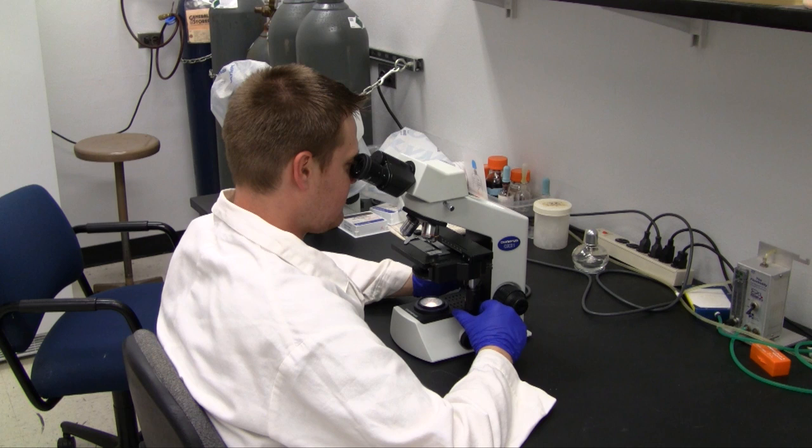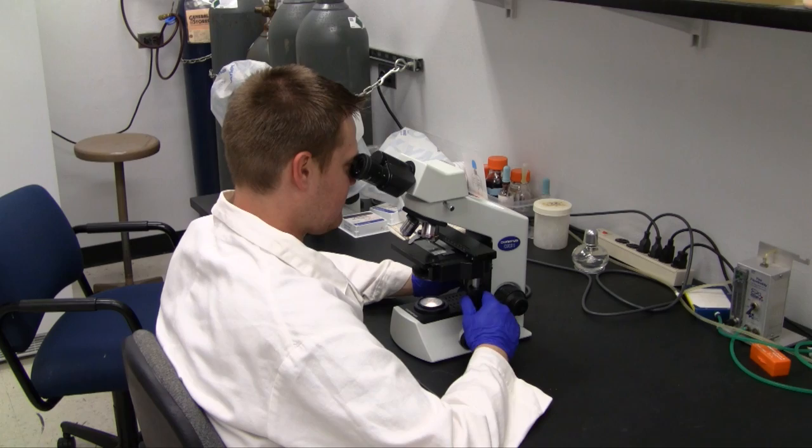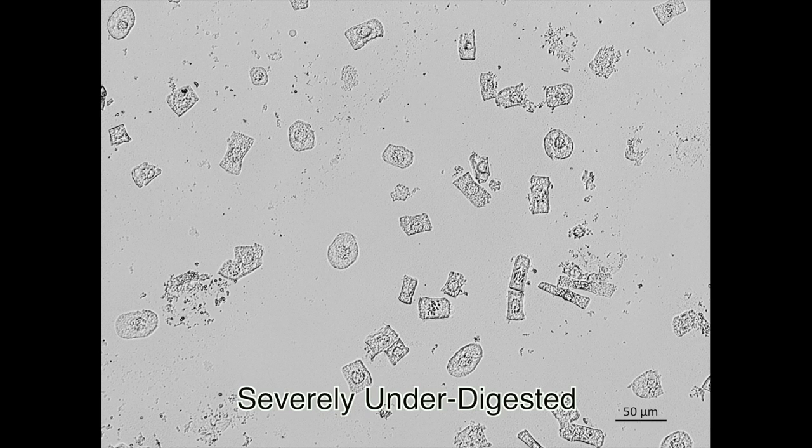The success of a digest, and therefore the hybridization itself, is determined by the morphology of the metaphase spreads on the slide. Examples of underdigestion through overdigestion will be presented. Severely underdigested cells have fully intact cell walls and retain their rectangular shape. Slides with this appearance should not be used for hybridization.